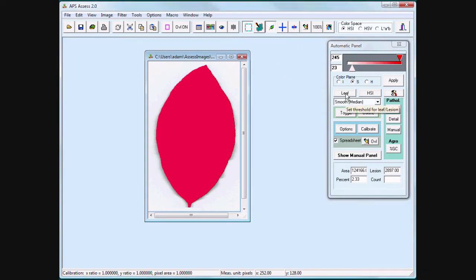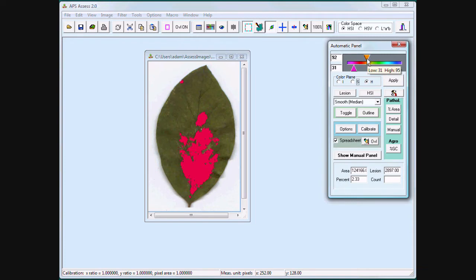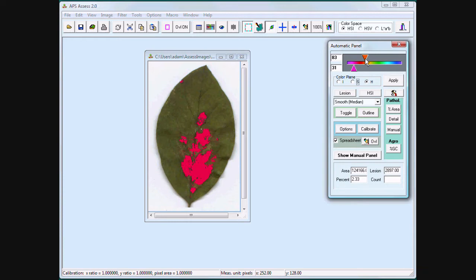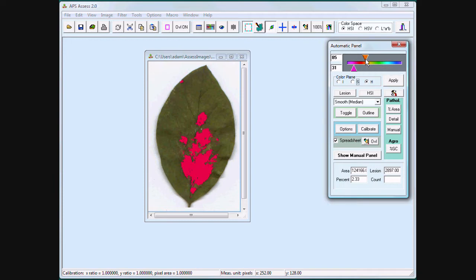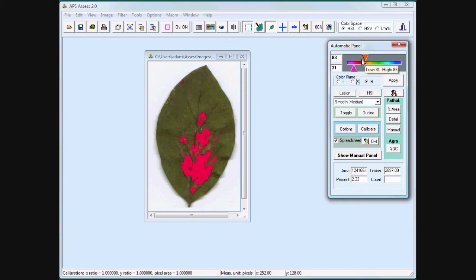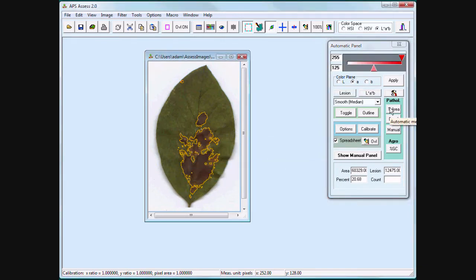When I threshold the lesion, I am going to use hue. And by selecting the leaf as the area of interest, I ensure that I don't select any of the background as part of my thresholding. Click Percent Area.